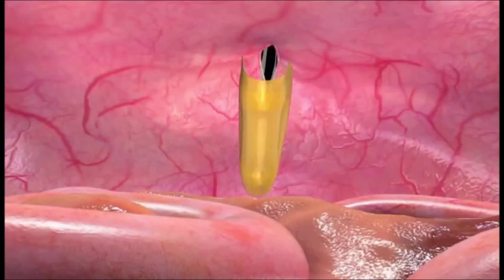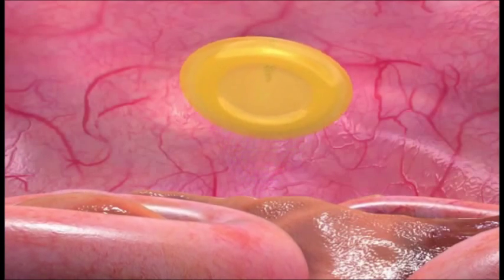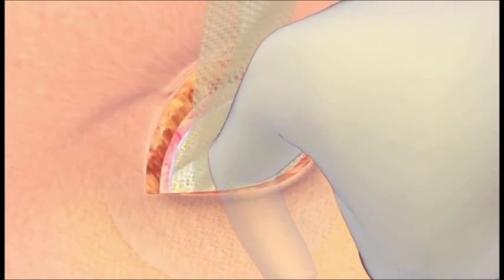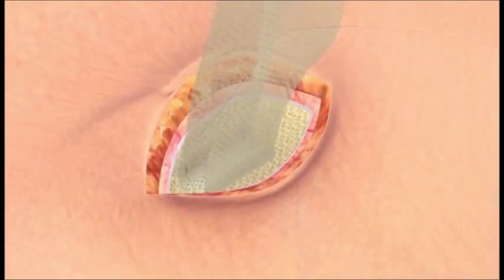Gently pull up on the fixation straps and sweep around the anterior portion of the v-patch to ensure it is flush against the abdominal wall with no bulk tissue trapped between the device and the abdominal wall.